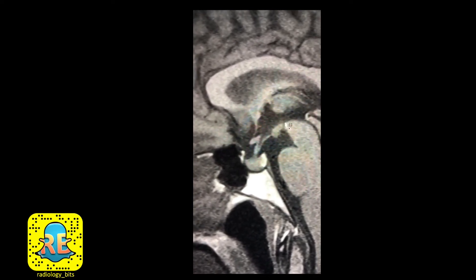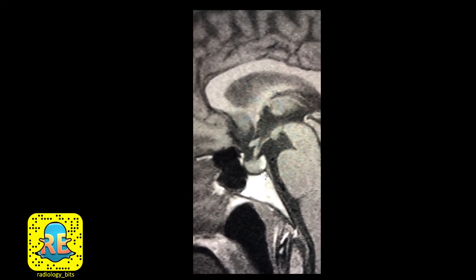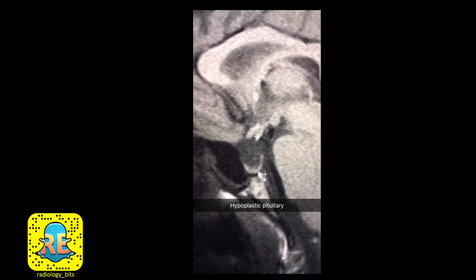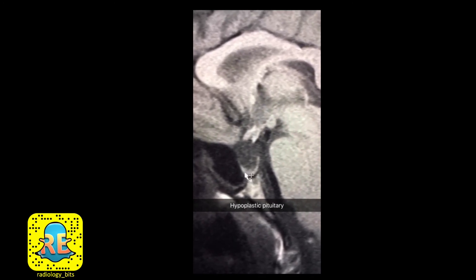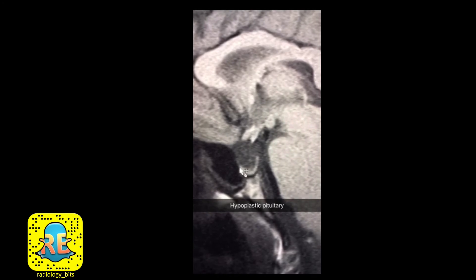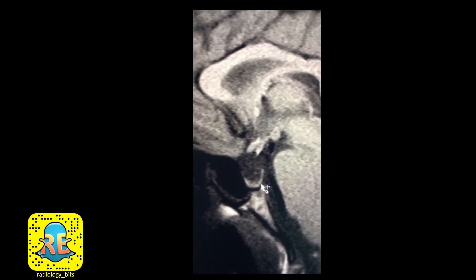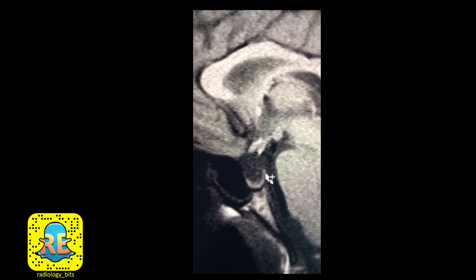Now let's return to the abnormal case — a 22-year-old female patient. The first thing you notice is that the pituitary gland is very small and flat. At this age you'd expect a larger gland, so this is a hypoplastic pituitary gland. The second thing to look for, as emphasized, is the bright spot representing the posterior pituitary on T1 — which you cannot see in its expected location here.